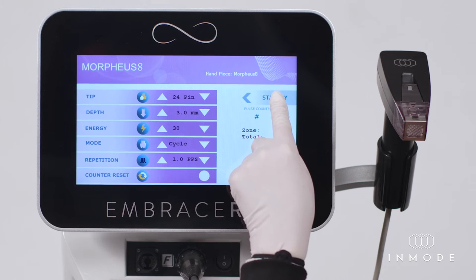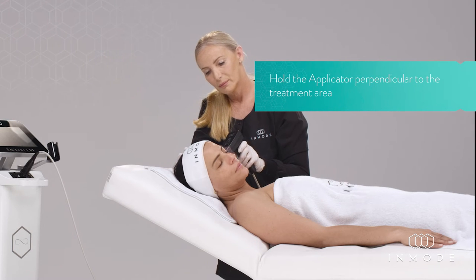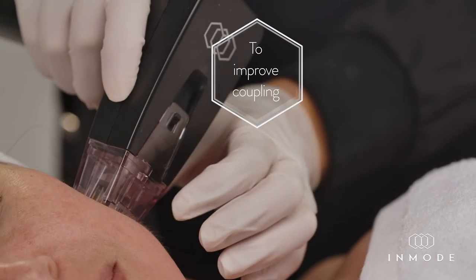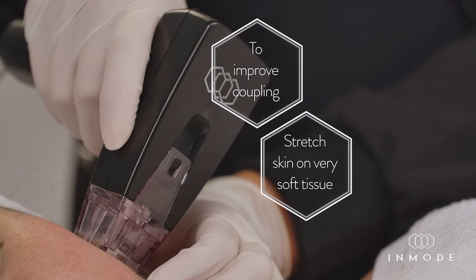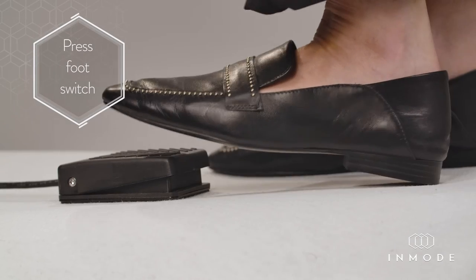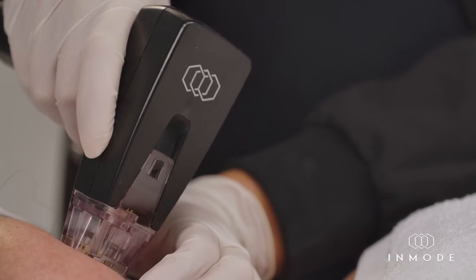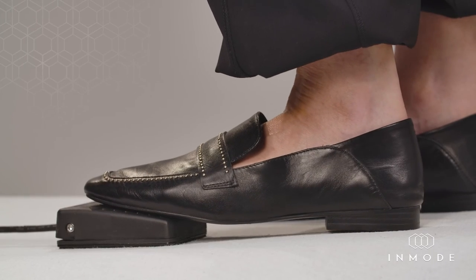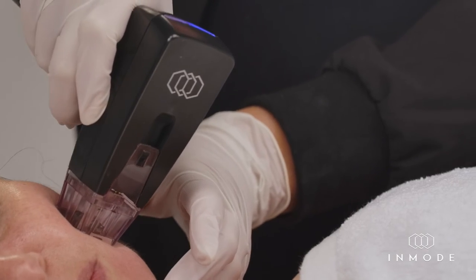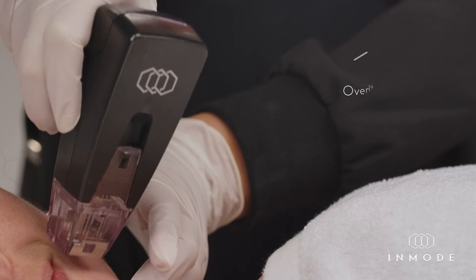Switch from standby to ready mode. Apply the applicator perpendicular to the treatment area while ensuring full contact of the electrodes with the skin. To improve coupling between the skin and the tip, stretch skin on very soft tissue or pinch on bony areas. Press the footswitch to start treatment. Work with the footswitch as described earlier based on the chosen mode of operation — cycle or fixed — and repetition rate. Move the applicator to the adjacent area with an overlap of approximately 30 to 50%.